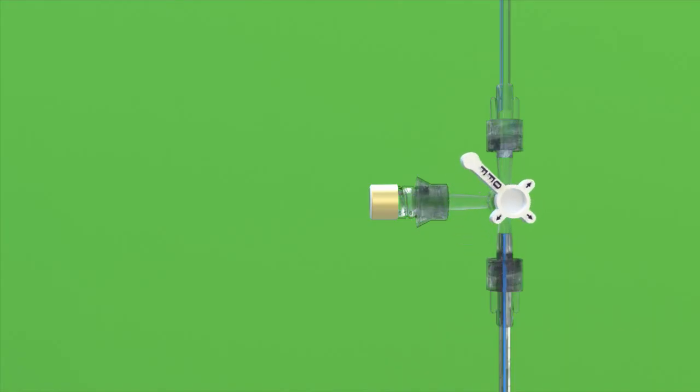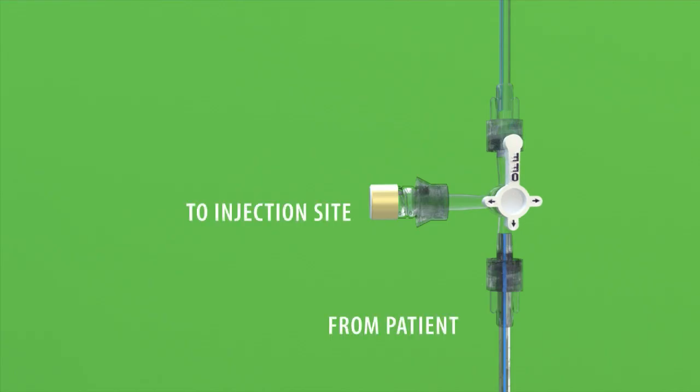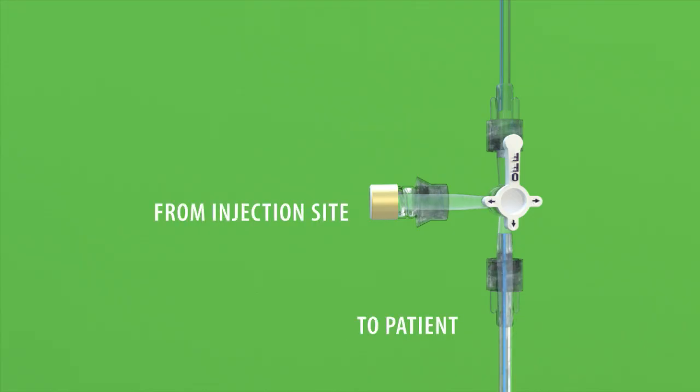Finally, if the OFF position is rotated off to the main system stopcock, fluid can flow either from the patient's catheter to the injection site, or from the injection site towards the patient's catheter.